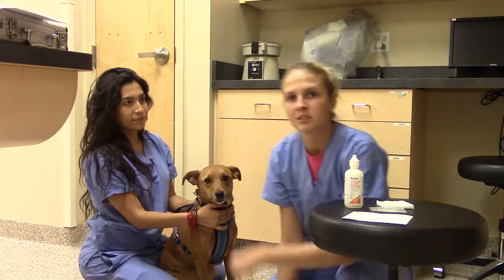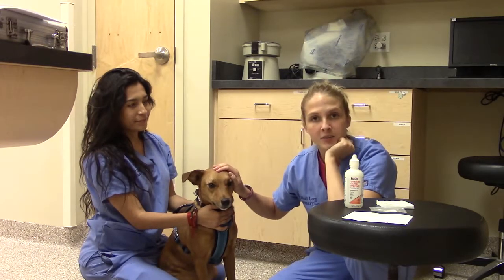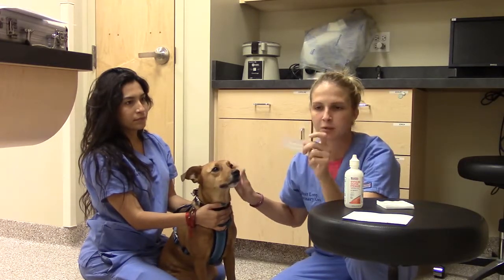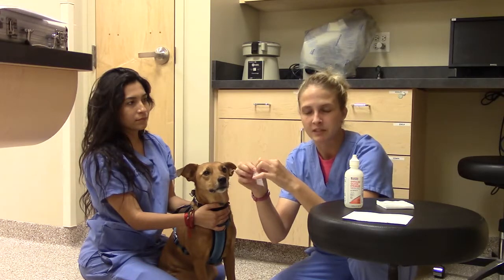My name is Sarah Levine. We're going to be doing a Schirmer Tear Test on our patient here. This is for Vet 220. I've got my supplies over here, and I've got my test here, which is still in the envelope. I'm going to go ahead and fold that ahead of time — this is going to make sure that we keep the ends a bit sterile.